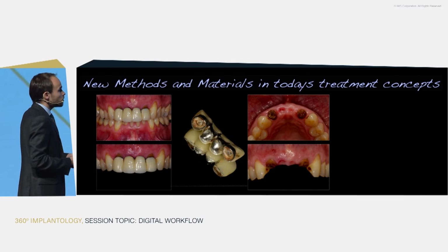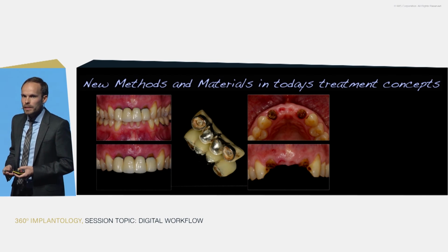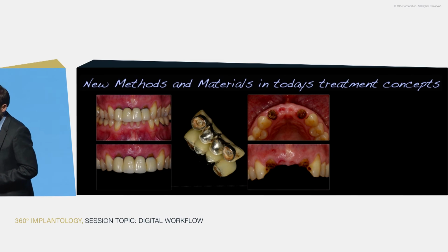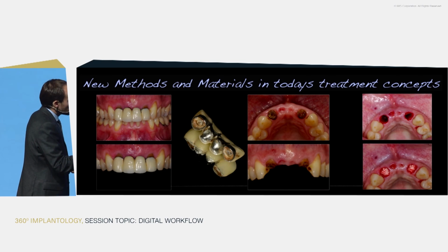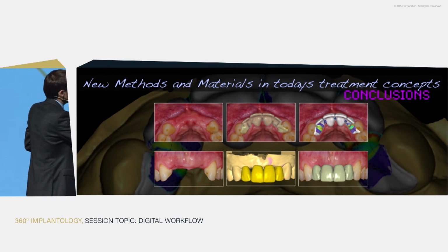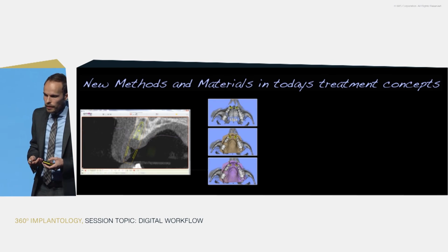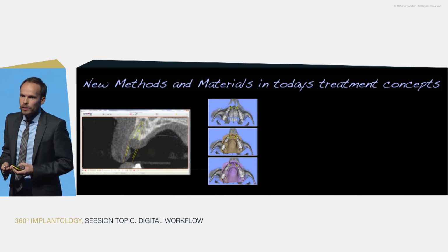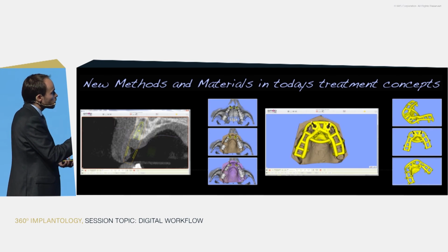When we are in the anterior zone, it will be again more complex because we are fighting with more aesthetic demands of our patients. So the patient came to us, he lost his 4-unit anterior bridge, the tooth fractured, and you see we took out the roots, we did some ridge preservation, and once again the same technique all over. We did the setup, the digital setup for our patient, we did the planning according to this digital setup, we placed and we created our surgical template.